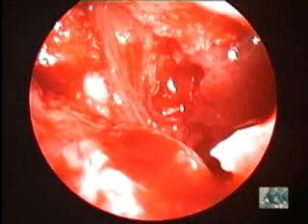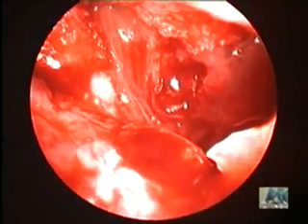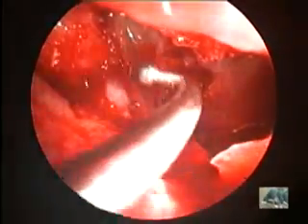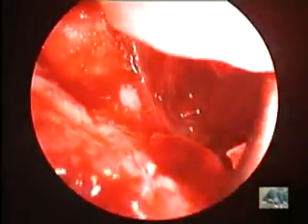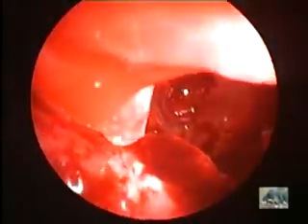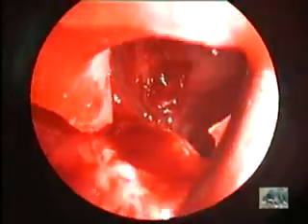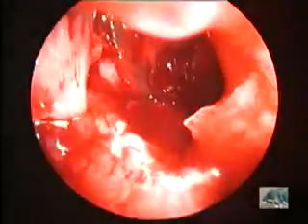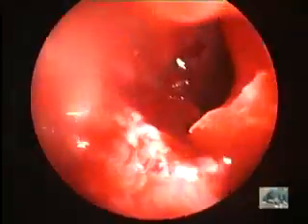So for the audience, what we're talking about is this bit of bone here, which has been pushed in. So I'm just going to get Sham to slide the ball probe underneath it and pull that out. That's one of the problems with the inferior meatal approach, is that the inferior meatus is a very thin, large area of bone and fractures quite easily.